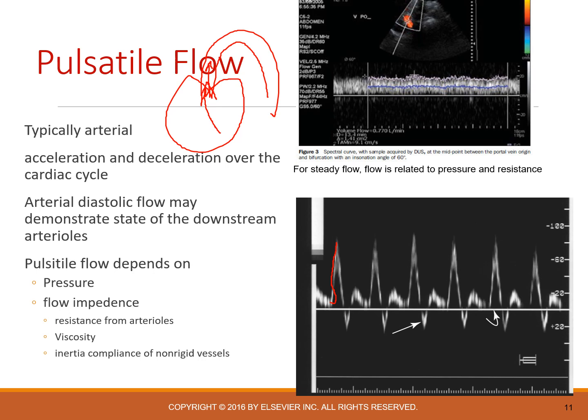At the end of systole, my heart starts to relax, and as it does, the pressure moving the blood forward starts to subside, and we see the forward motion of those cells start to slow down. Now, in this particular waveform, there's arterial constriction, or some resistance in the bed, so that when there's nothing pushing those cells forward, they're actually going to move backwards.